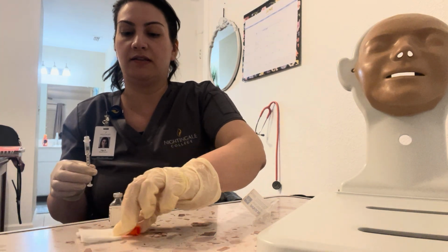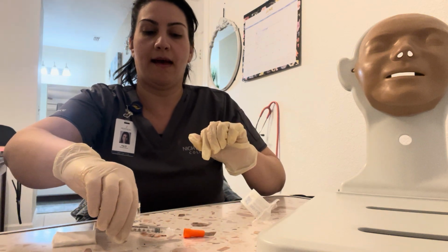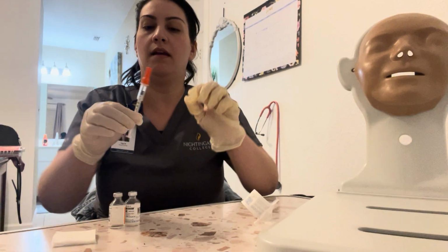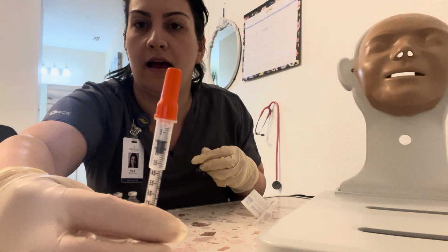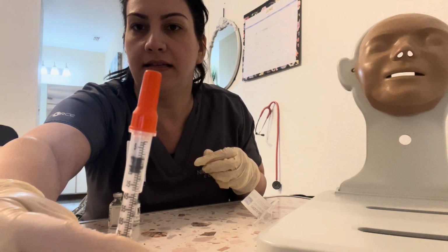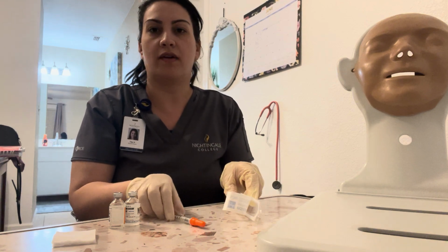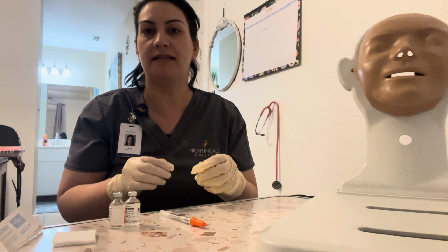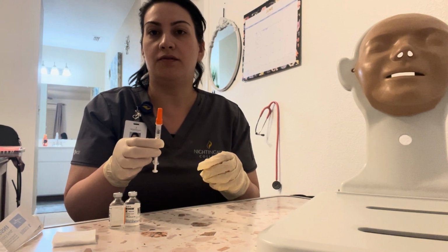Next, we're going to use the scoop method. We're going to cap it. Nurse and I verify against the MAR, 12 units of insulin for my patient subcutaneously. Medication is ready to go, and if I was going to prepare this away from the patient's bedside, I will label the patient's name and the dosage amount.